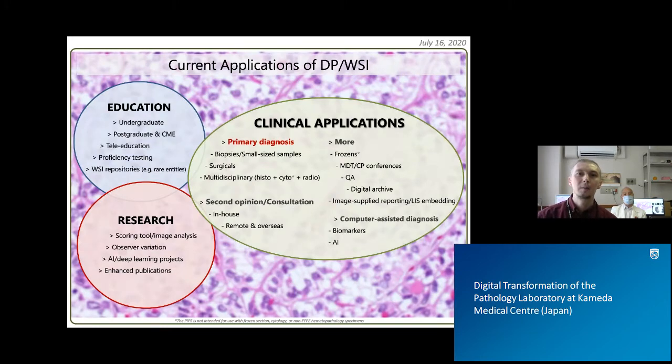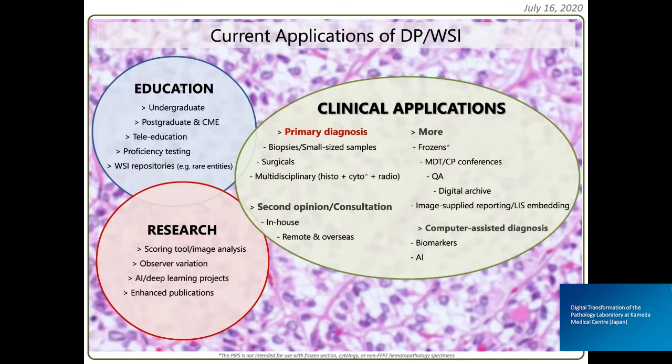And I'm going to remind you about the current applications of digital pathology. I'm going to call it DP or whole slide imaging, WSI. So it spans through education and research to clinical applications. The people who join us today from academia might be quite familiar with these parts and the involvement of whole slide imaging in education and research. And you have, guys, your personal experience with that. But the most important part, no doubt, is the clinical application. And while the most important, it's also the most difficult to afford.